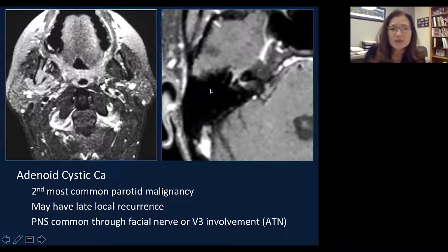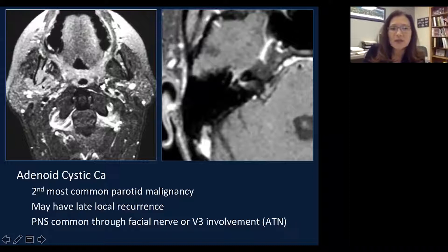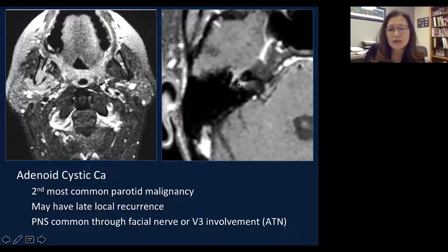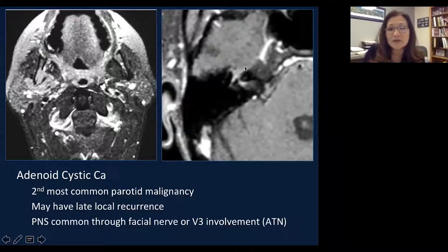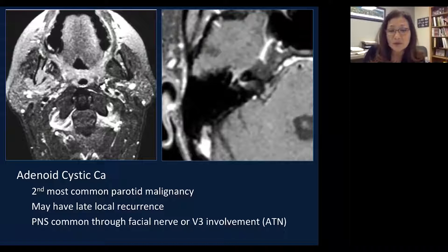When you look carefully, because adenoid cystic carcinoma is notoriously known for perineural spread, and the facial nerve runs through the parotid gland canal, you have to follow the facial nerve. Looking higher up, this is the internal auditory canal. You can see enhancement of the canalicular portion of the internal facial nerve, as well as the labyrinthine segment and the geniculate ganglion of the facial nerve — all abnormally enhancing.